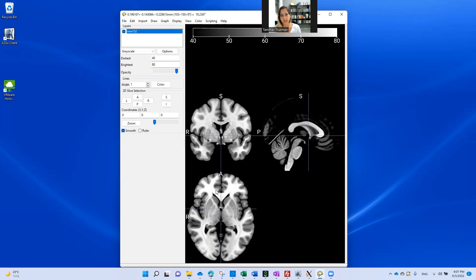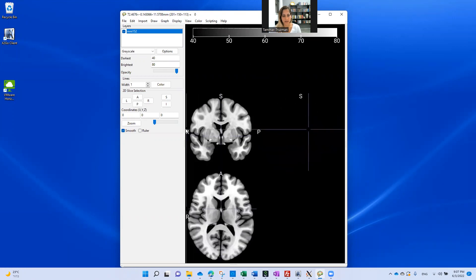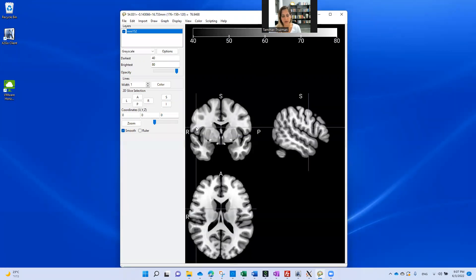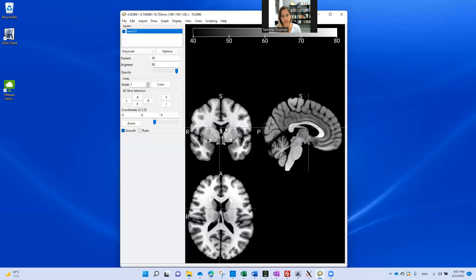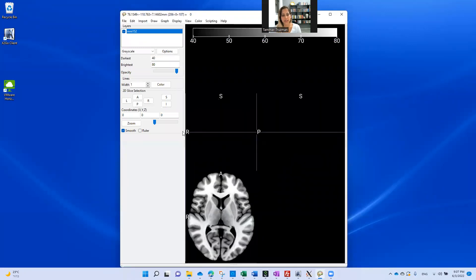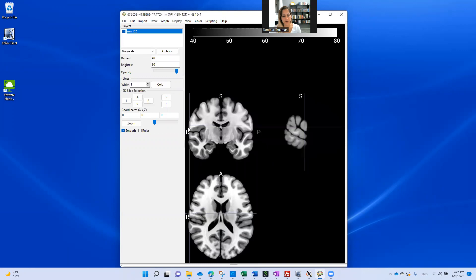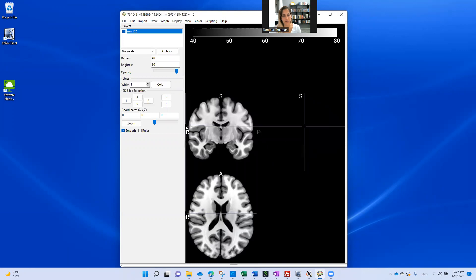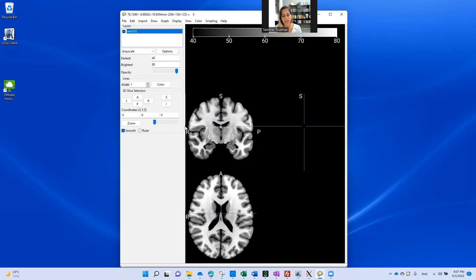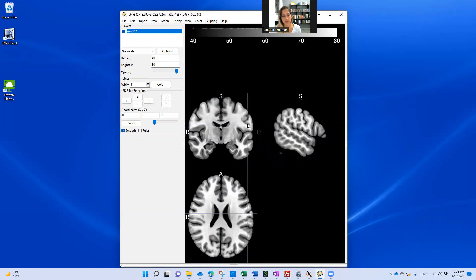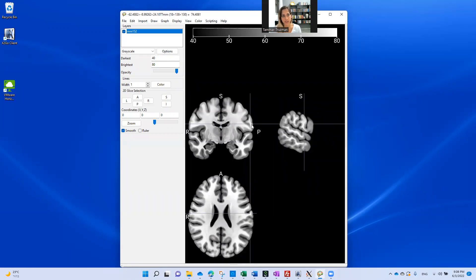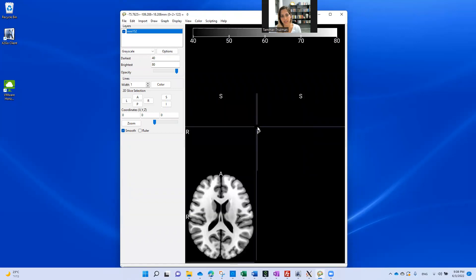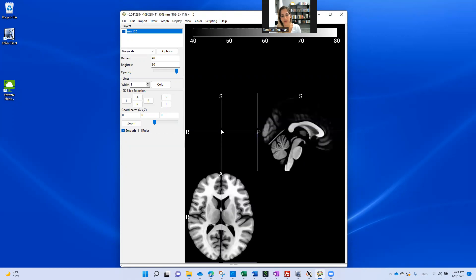For example, I'm taking the X dimension going from the very right edge of the right hemisphere across all the brain to the left hemisphere. I can see that at the very edge of the right hemisphere, this is the value of 76 millimeters, meaning this is a distance between the zero point in the middle of the brain to the very edge point in millimeters. If I go to the other side in the left hemisphere, I can see this is in negative numbers, going all the way up to minus 76 almost.